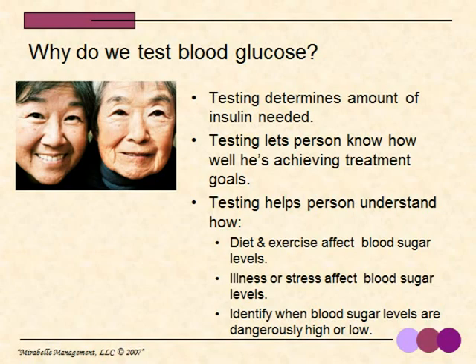Just as blood pressure can change within minutes, so can blood sugars, and that is why many diabetics test their glucose several times a day. Other diabetics are more stable, and because their blood sugars don't vary greatly throughout the day, they may test their levels less frequently. The important part to know is that the blood must be monitored.